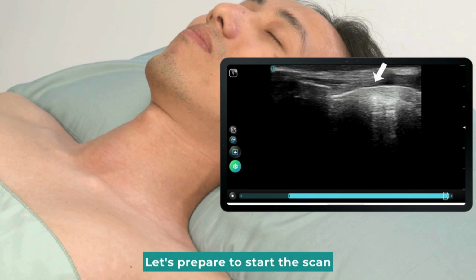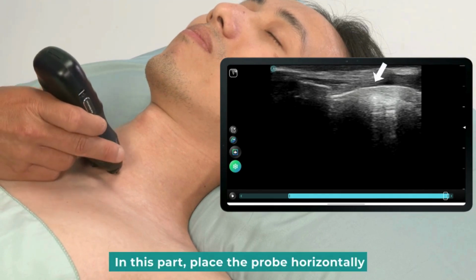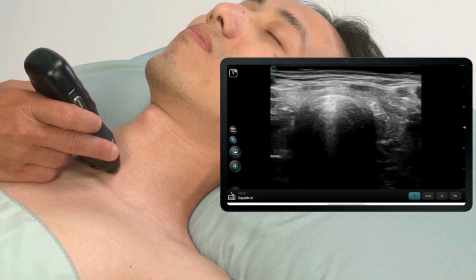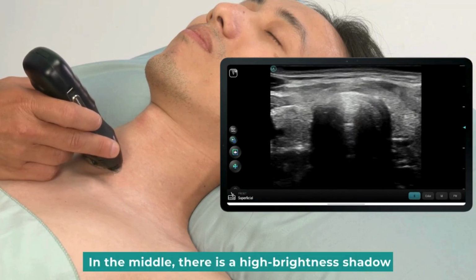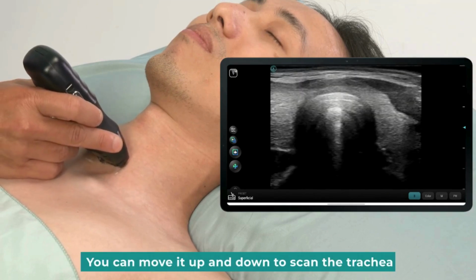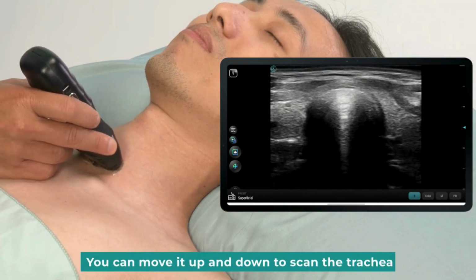Let's prepare to start the scan. In this part, place the probe horizontally. This would be easier to locate the trachea. In the middle, there is a high brightness shadow, which is the trachea. You can move it up and down to scan the trachea.